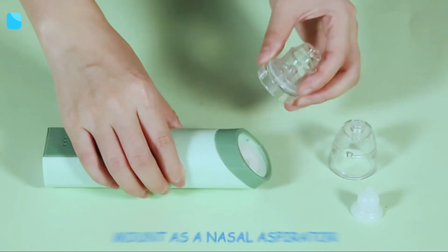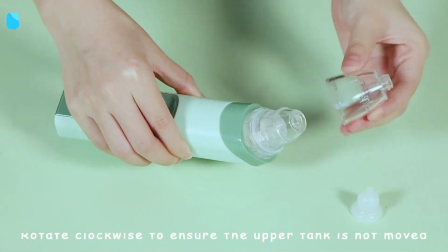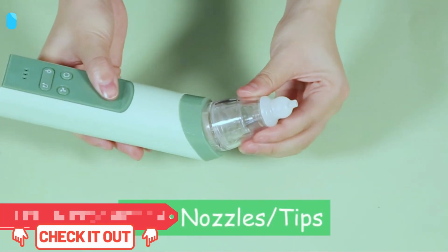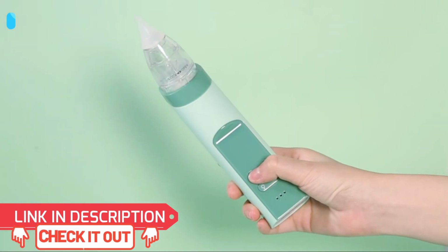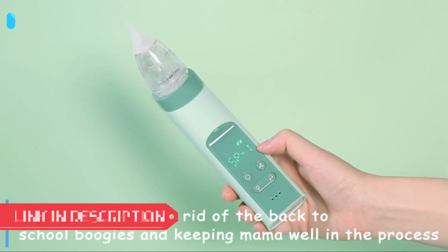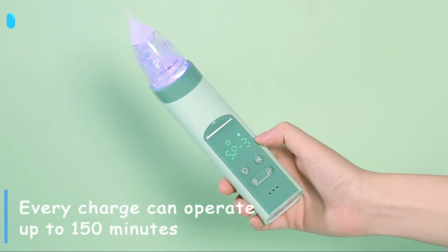Looking at the device here, you can see there's four buttons. The top middle one is your power button, and that'll turn it on to suction setting 1. If you'd like a stronger suction setting, underneath is the S button, and it'll turn it on to suction setting 2. Press it once more, and it'll turn on to suction setting 3. To turn it back down to suction setting 1, simply press the S button again.